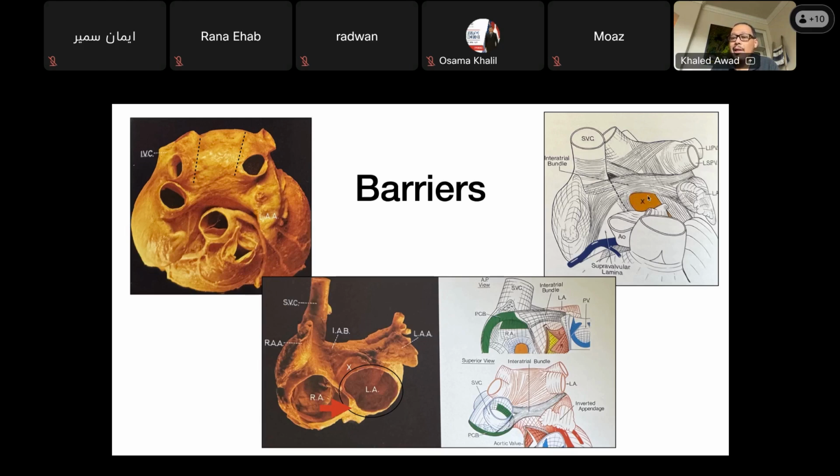Why is that important? If you're ablating here, especially if you use RF, be very careful, because a steam pop in this area or excessive contact force as you are working on the anterior surface of the left atrium, which is an area that we frequently have to work on. Be very careful with contact in this area.